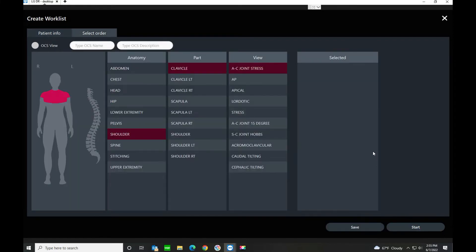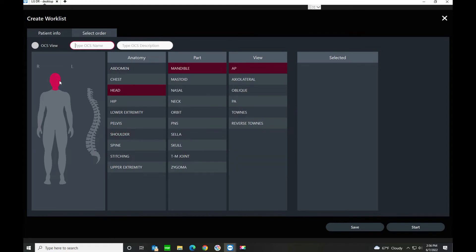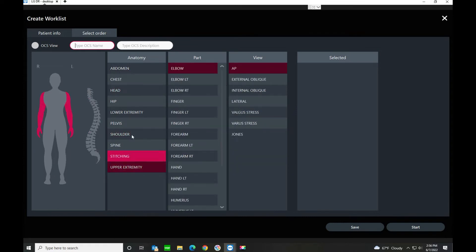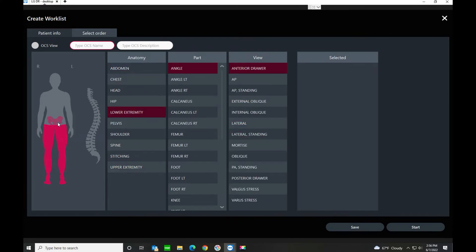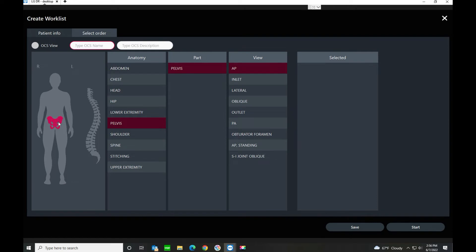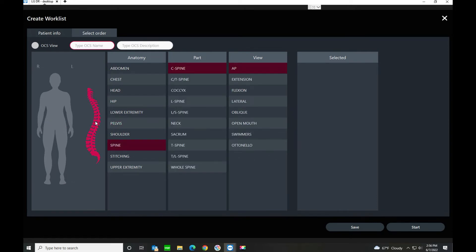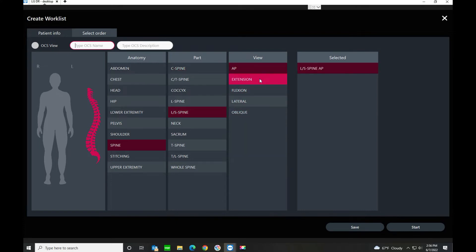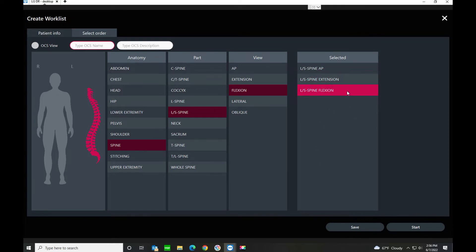Here we're at the exam view. There are a few different ways you can build your exam. You can use the anatomical drawing and select different body parts — as you see, this changes the views and the parts that are highlighted. You can look at the pelvis, or if you're doing just spine work you can look at the spine and build your study that way — L-spine, AP, extension, flexion. Select them again to remove any.